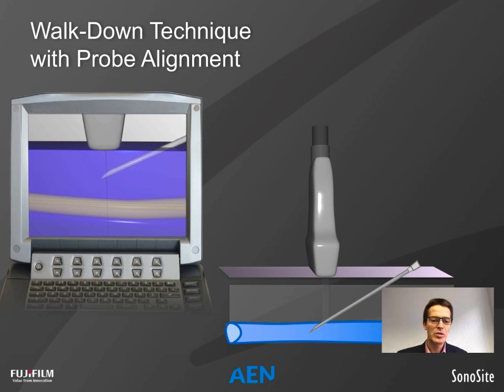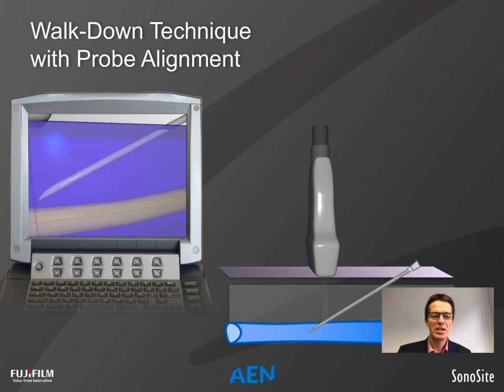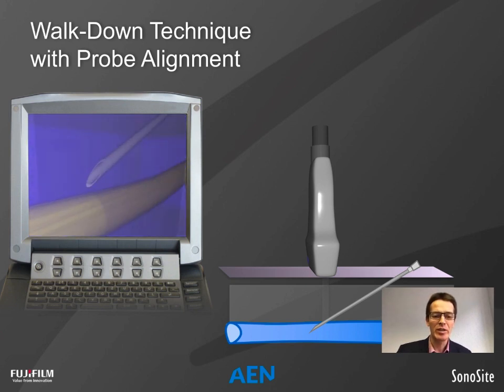We insert the needle again to get another needle tip reflex on the ultrasound screen, and we do this again and again until we approach the nerve. And now we look from a different angle in the scanning plane. So tiny little maneuvers once we get very close to the target structure, and now we can inject the local anesthetic.